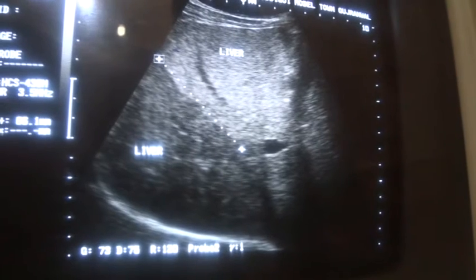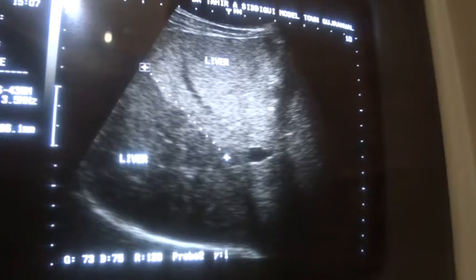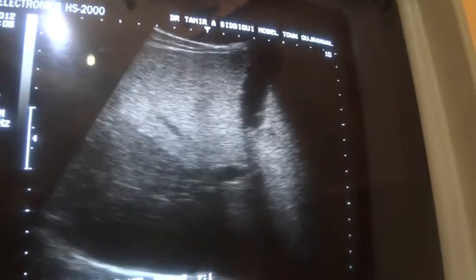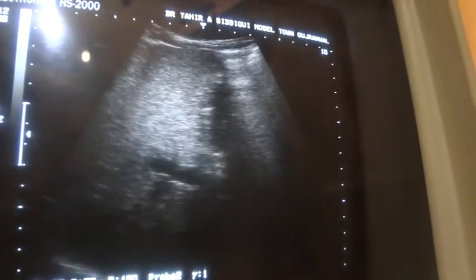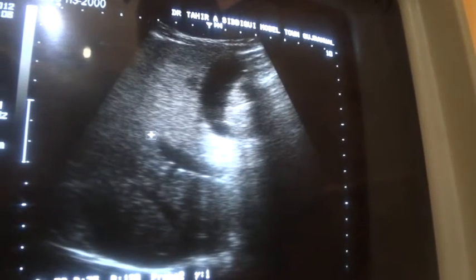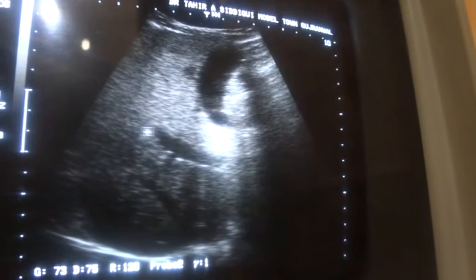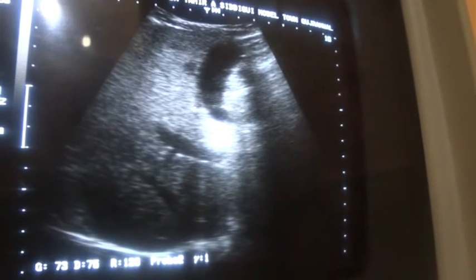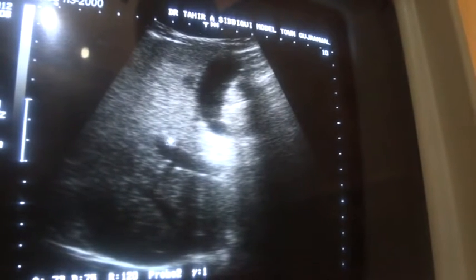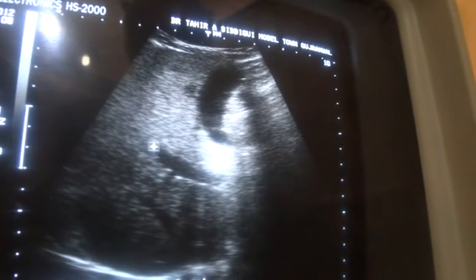See the sharpness of the vessel, note the blurriness of the vessel. Now the periportal echoes are seen decreased, attenuated. This is the portal vein, this is the gallbladder, and here, because the liver is echogenic in this area and shows fatty changes, the periportal echoes are seen attenuated or decreased.